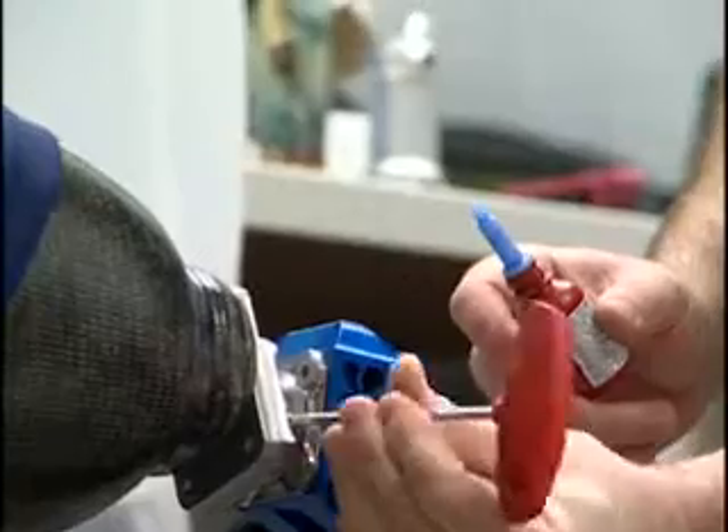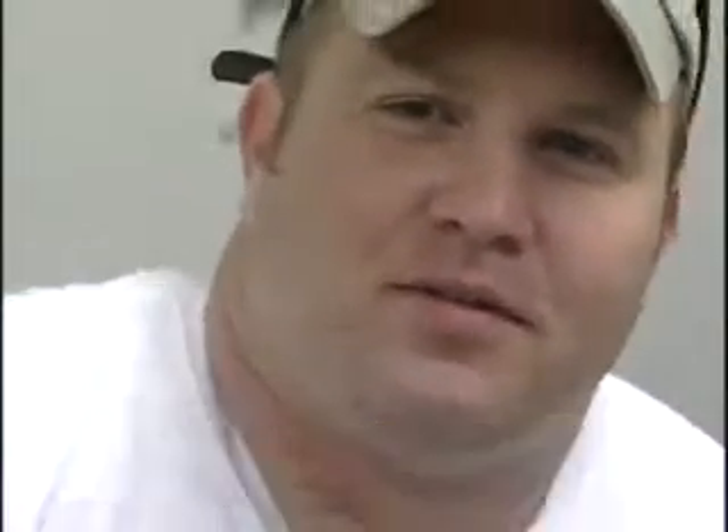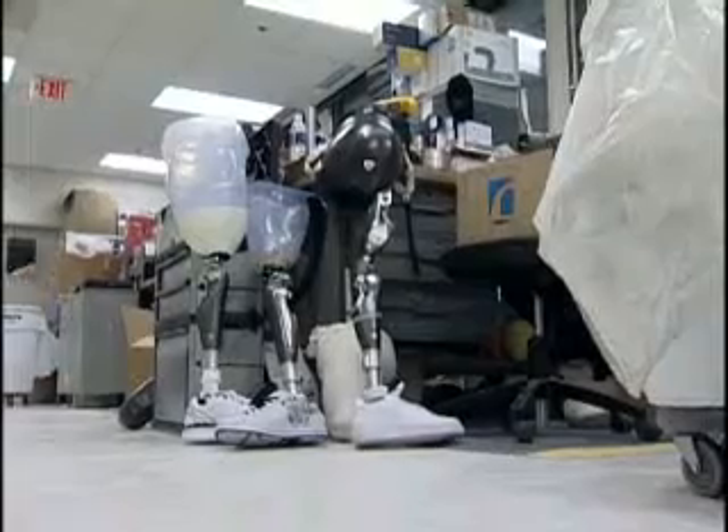Today, Sergeant Fairfax is getting a new knee. He was falling a lot with his old prosthetic — more embarrassing than anything else when you fall in public. Amputees like Sergeant Fairfax come to Walter Reed to get state-of-the-art prosthetics.